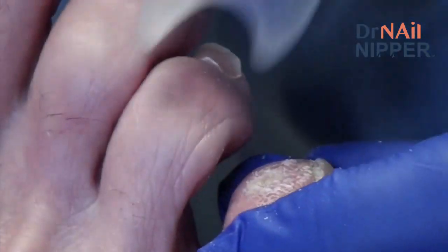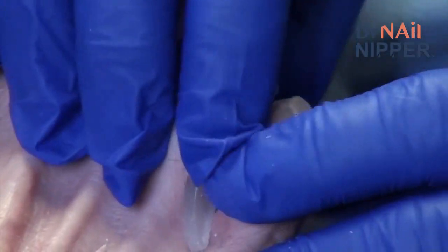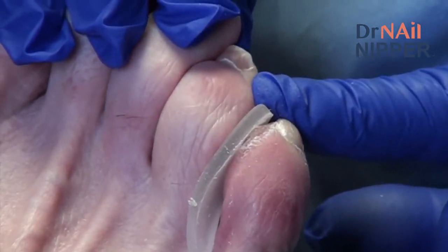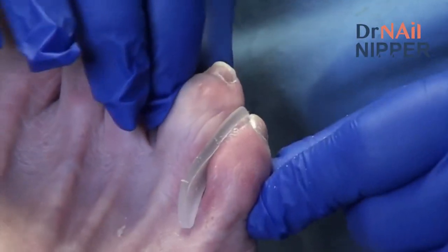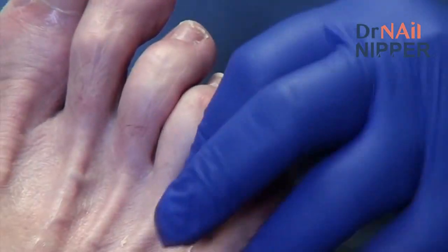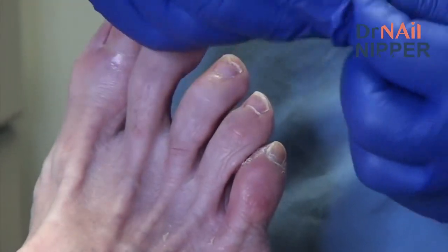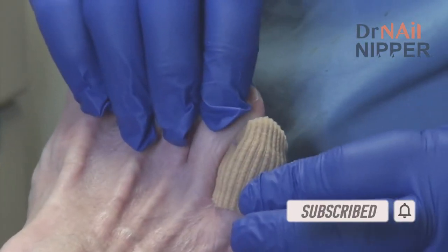So we have a little pad here that's made out of just gel. And if you put that right in between here, it's going to cushion those two bones and stop them from rubbing against each other. Once you get your sock on, that will usually stay right where it is. Sometimes you may have to tape it to one toe or the other, or even just tape these two toes together, and that will hold it in. Another option would be there's a little toe cap that looks like this that has gel on the inside, and you could put that over the toe and it's going to cushion it like that.